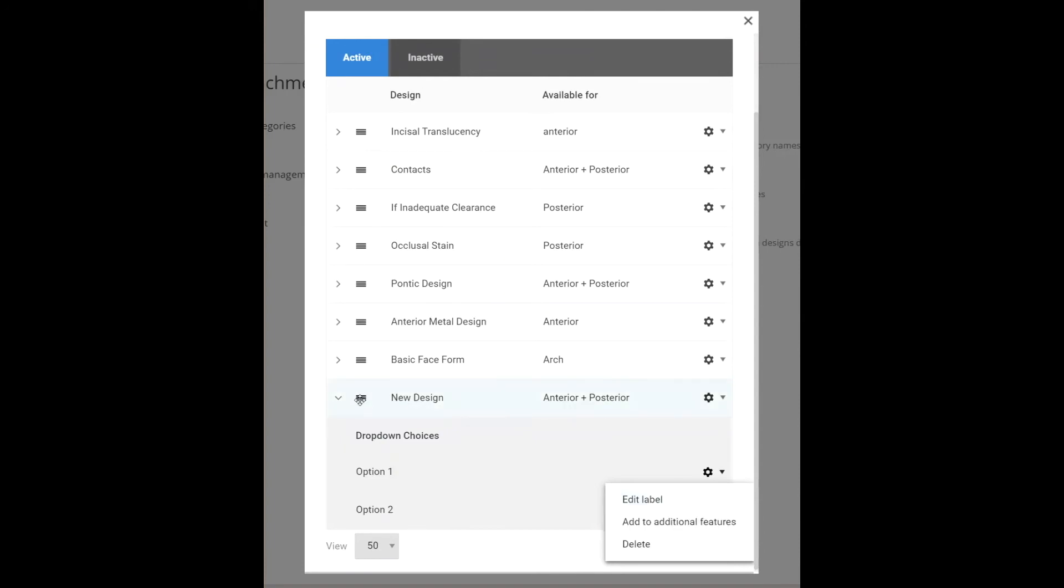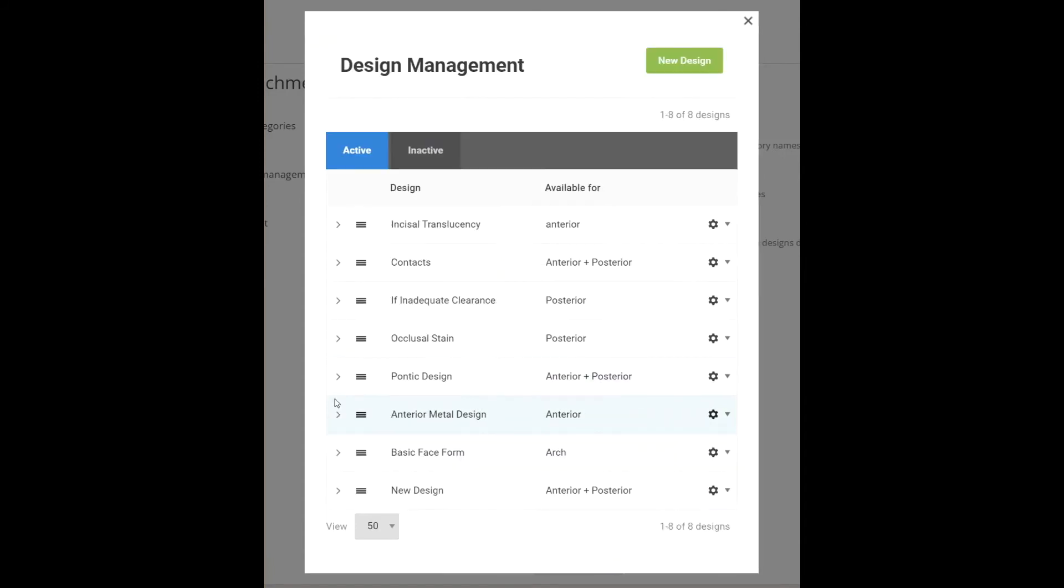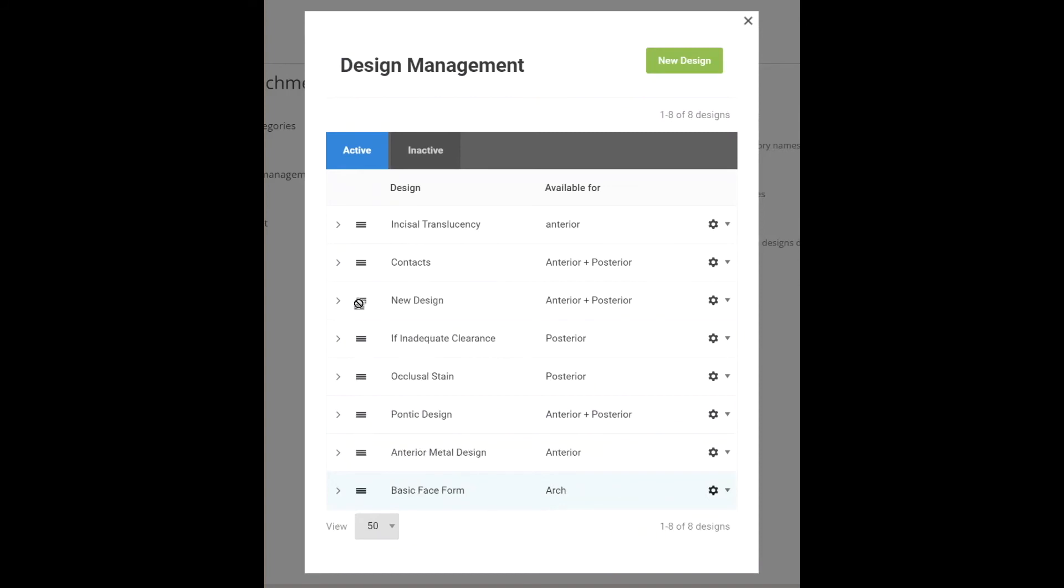You can also customize the display order so that the more commonly used designs show first and are easier to enter. For example, let's put our design at the top.